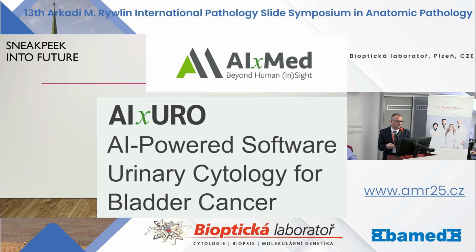But when you have urine, in 99.9% you are looking for urologic cancer, normally nothing more. You can see some other malignancies, you can see lymphoma, spindle cell, and so on, but these are really rare cases. You are looking for urothelial carcinoma. And it's really tiresome after some slides. You don't want to look at any other cells anymore.